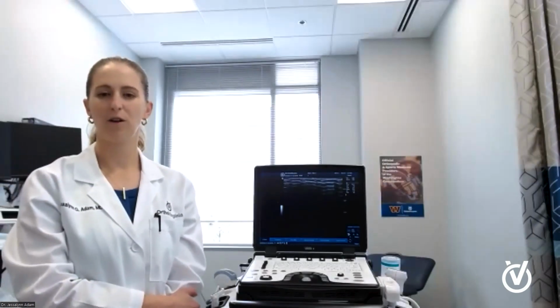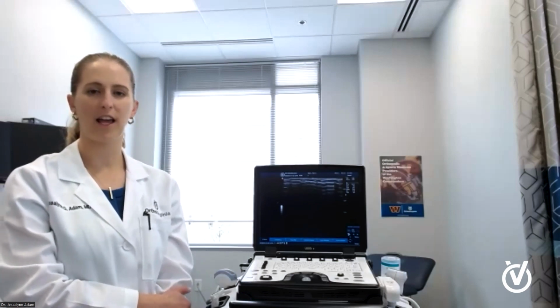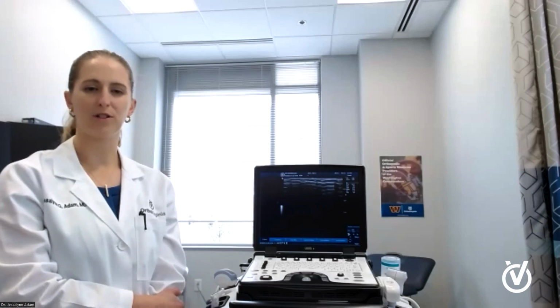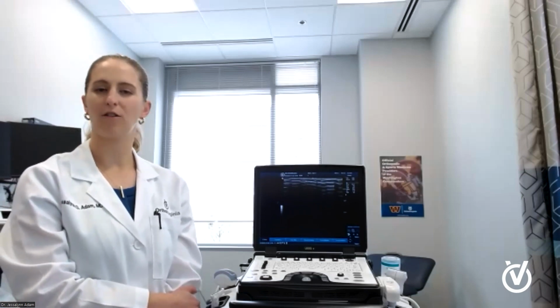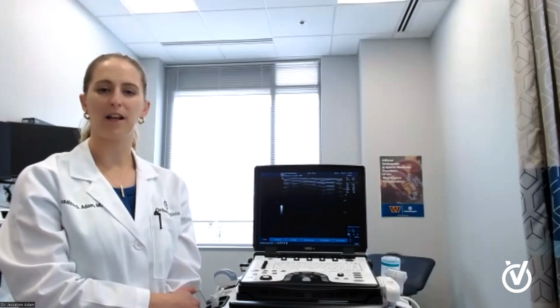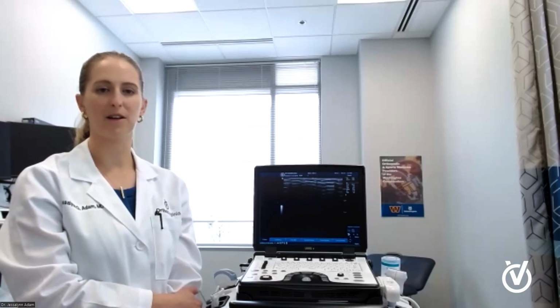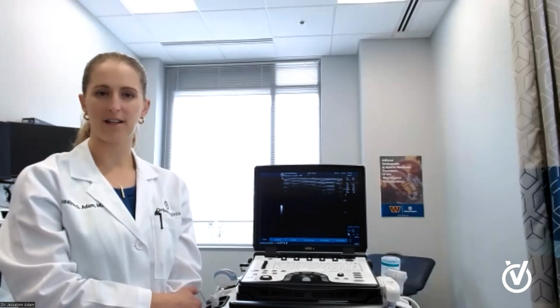Thank you. What about on the spine? Can you use ultrasound on the spine or do any procedures that help with low back pain? It depends. So there are certain procedures where fluoroscopy, or using live X-ray, is more beneficial. So procedures where you're going in and around the nerves, fluoroscopy may be better. But if you're looking to do things like a trigger point injection where you're just injecting the muscle around the spine, yes, absolutely.